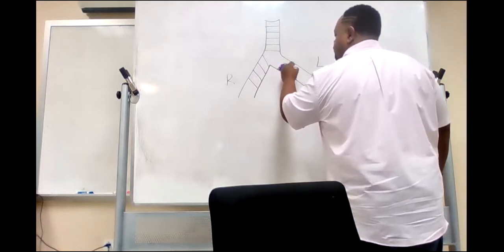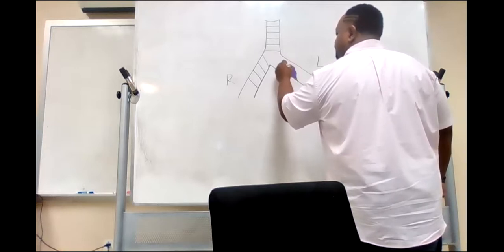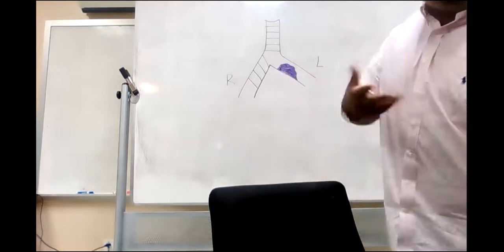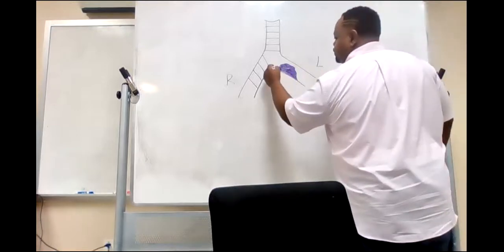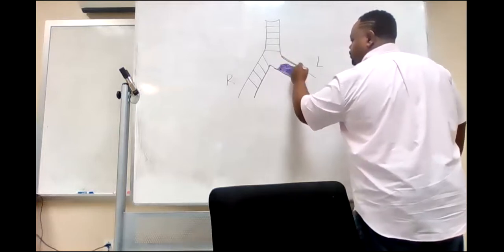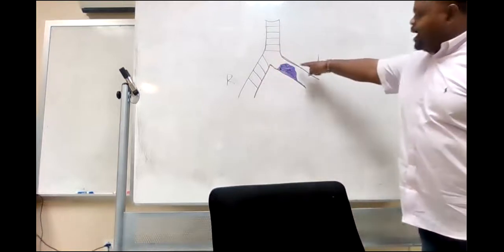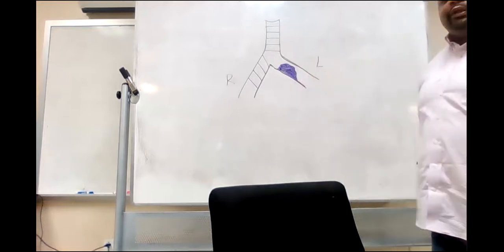Well, that tumor may be so large that it is impeding my ability to ventilate. See that? I don't have much space to ventilate right there, do I? It's a big old tumor in there.